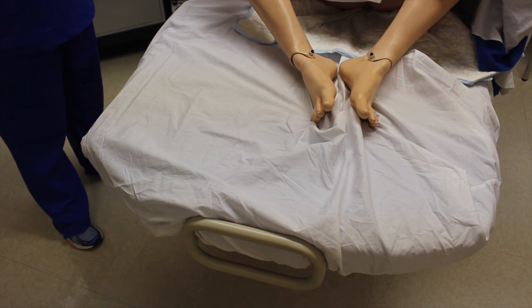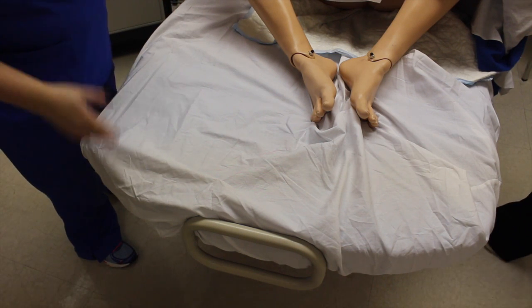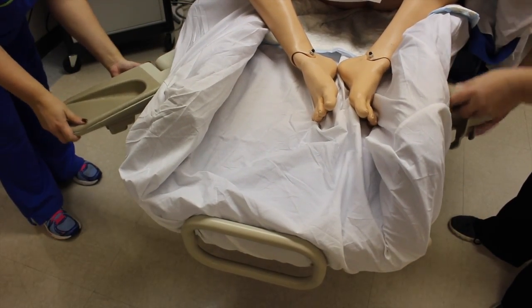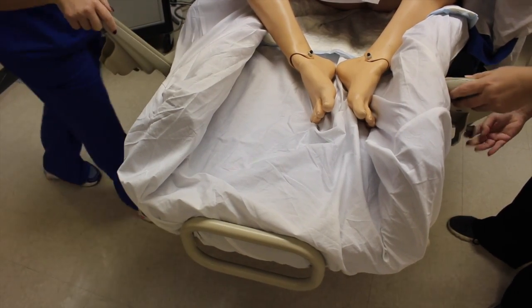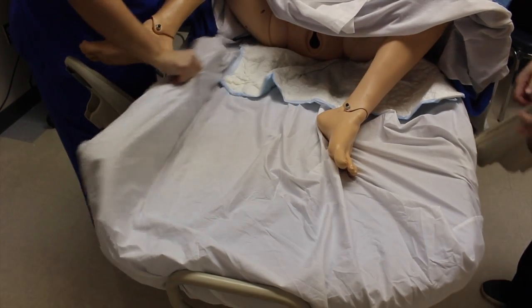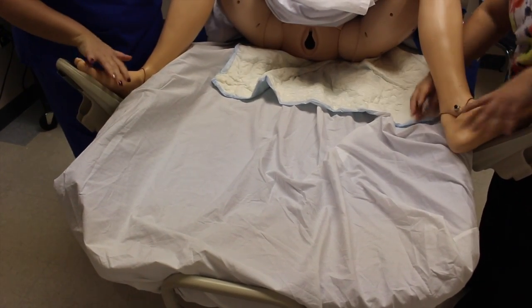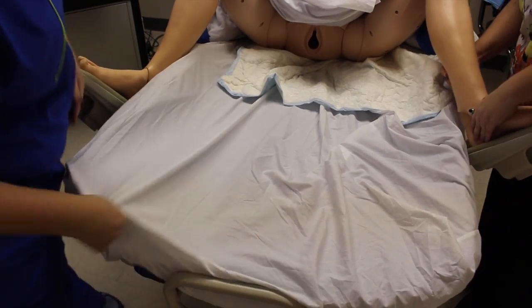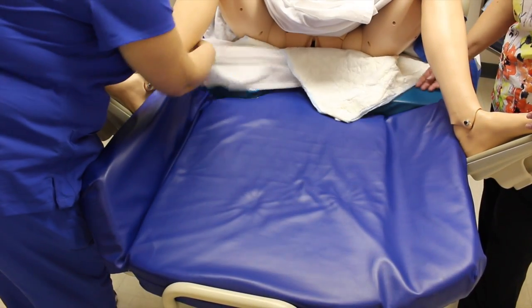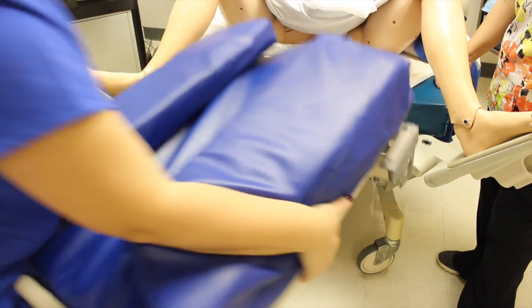When the patient gets complete, one of the things that the nurses do is get the bed ready for the delivery. These are labor beds. They operate a little different than hospital beds. These have a mark on the side over here. The stirrups come up for the patient's feet. Patients who have an epidural, their legs are going to be a little bit more floppy than patients who have complete sensation. Our mannequin's pretty close to an epidural patient with her floppy legs. Out of the way, and then the bed lifts straight up and up.